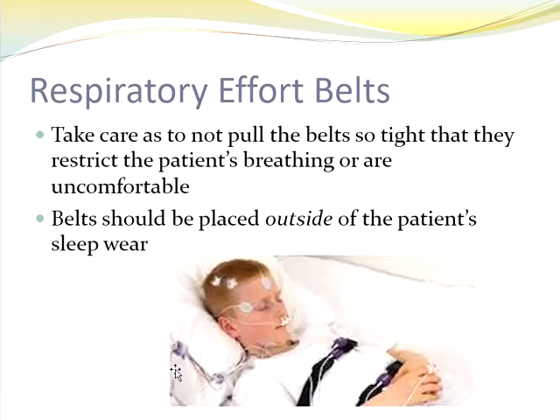They go outside of the patient's clothes because they're rougher material and we don't want them rubbing against their skin, and it's just more hygienic that way too. You will get patients who say, I never sleep with a shirt, I can't sleep with a shirt, and then I always just play up how rough the belts are. You need to wear a shirt so they don't rub against your skin. They're not too rough, but it's so much more hygienic when the patient wears a shirt.